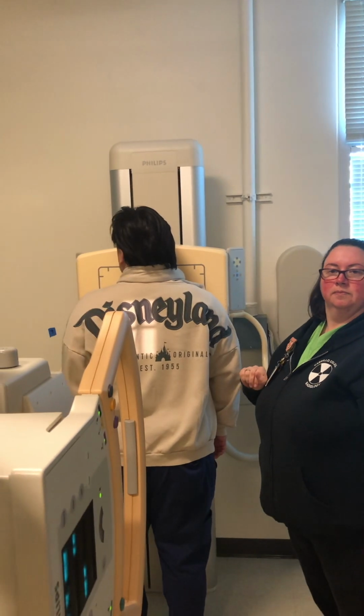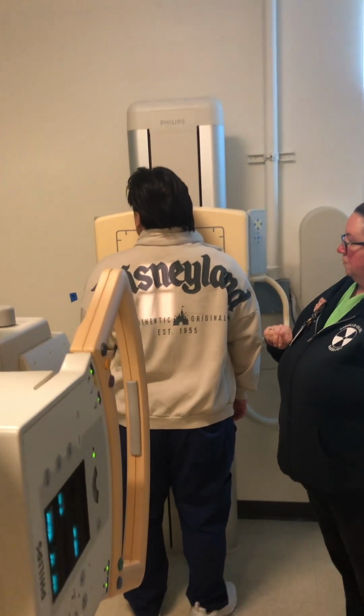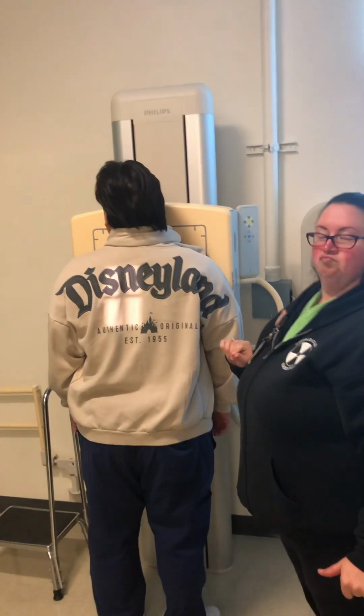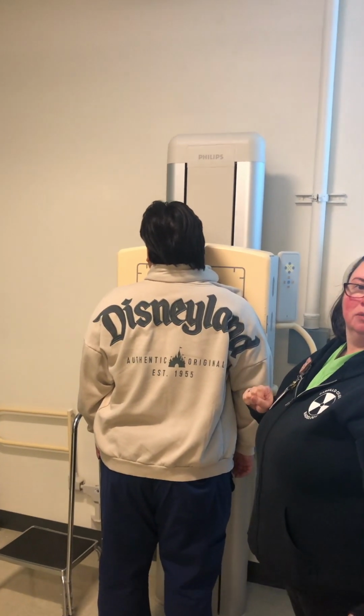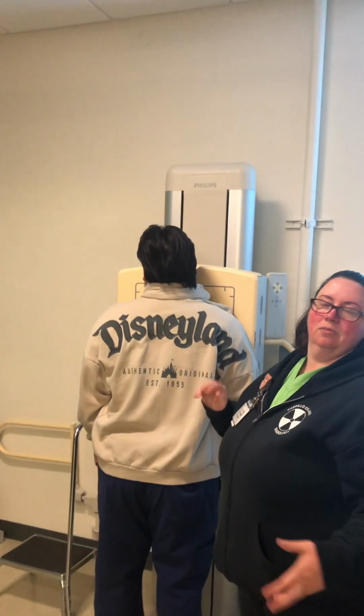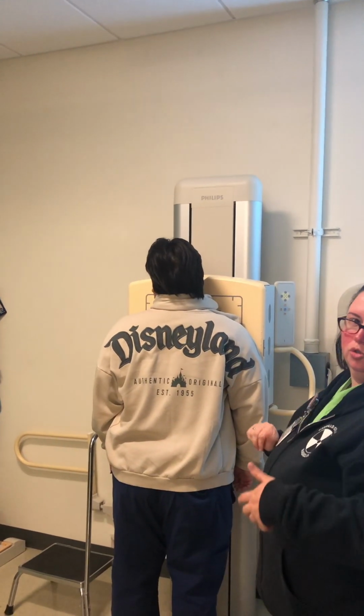So the lateral border should line up almost with the positioning of his EAM. Would that also be a good point to judge about that inch to help you? Then it depends on your patient, how thick their neck is. So I wouldn't necessarily use that as a true hard and fast rule. Okay.